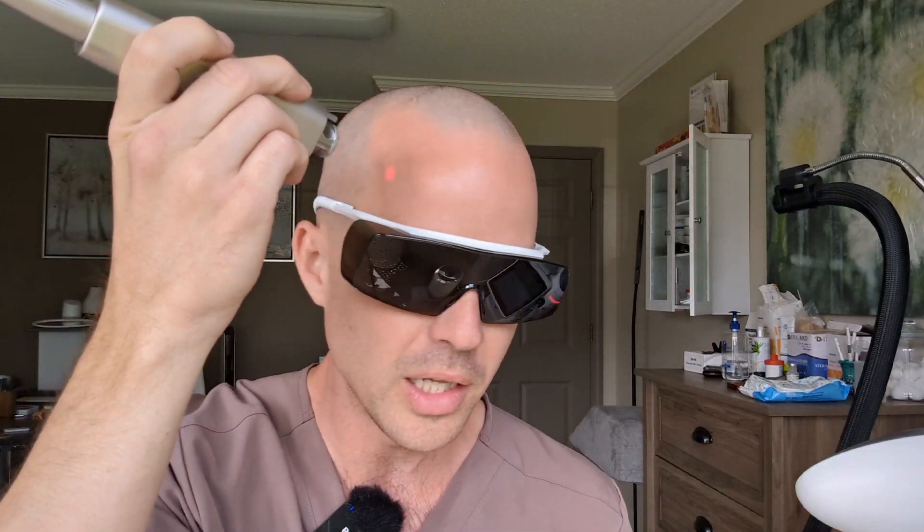One of the biggest differences between this and radiofrequency microneedling is you don't see anything — no mark, nothing on the surface. So I can go through and I feel it strongly. It feels like a quick pulse of heat that is intense. It's bearable but it's intense. I couldn't really do this very fast or have the frequency up higher without using the chiller or numbing. You'll see just a little bit of redness that comes in a few seconds after, and it'll last for maybe 30 minutes, maybe an hour tops.